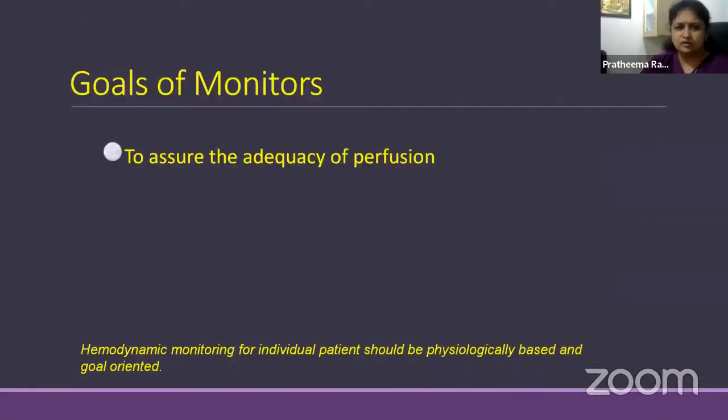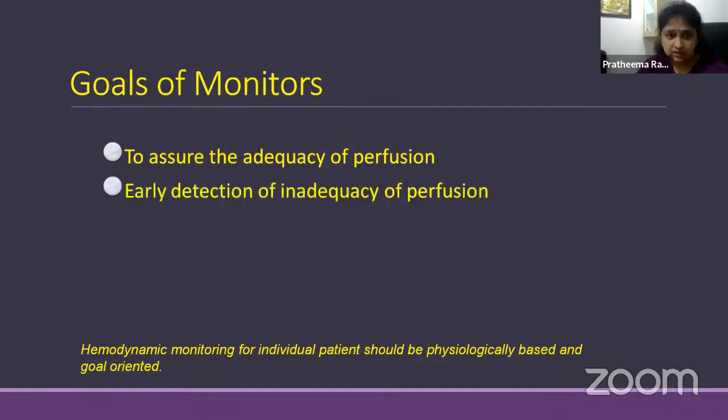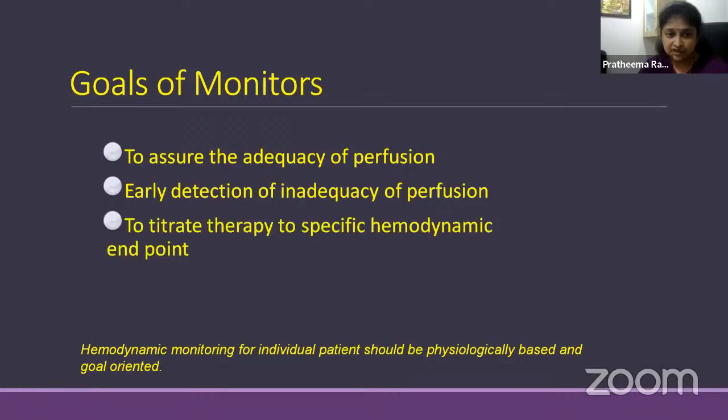So what is the goal of monitoring? What do you want to see? To assure the adequacy of perfusion. We are standing at the bedside. We need monitors to look into the patient. So monitors are a communication between the patient and us. We need to look into the adequacy of perfusion. Is the blood getting perfused well? And if there is any inadequacy, the monitors need to alert us early so that we can act upon it and prevent further deterioration.